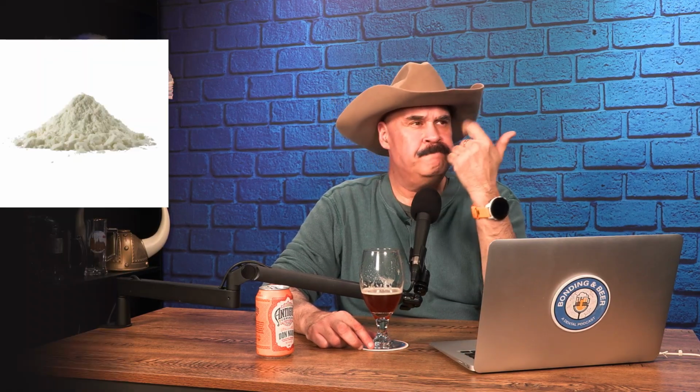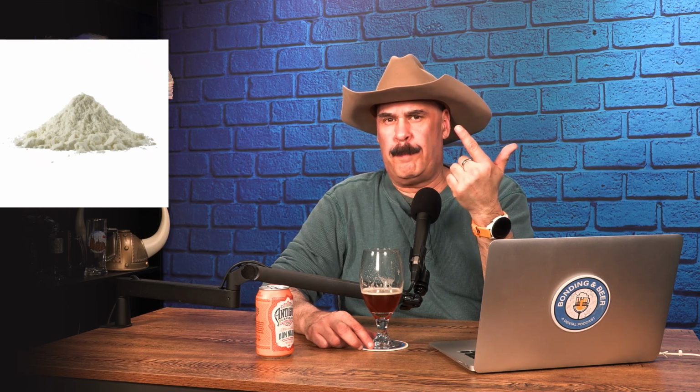Question number 2 from Dr. Roderick Cannon: What are the most common mistakes when it comes to sandblasting? Using the wrong powder, using the wrong powder particle size, using the wrong pressure, holding it too far away, or holding it too close. It's not rocket science, but it does require a little bit of practice. It does have a little bit of a learning curve. I would say the 3 most common mistakes are the wrong powder, wrong particle size, and wrong pressure.